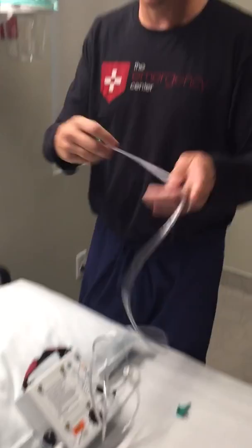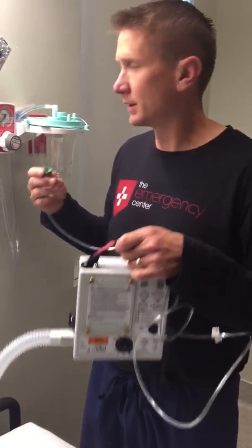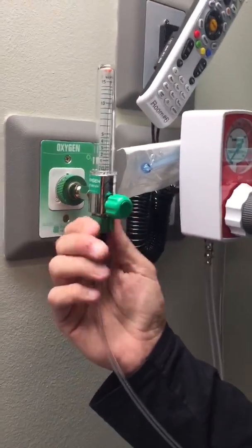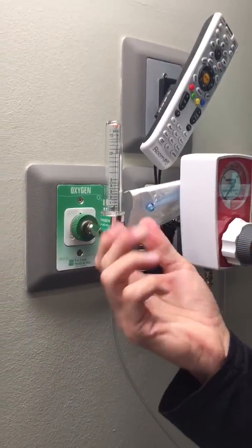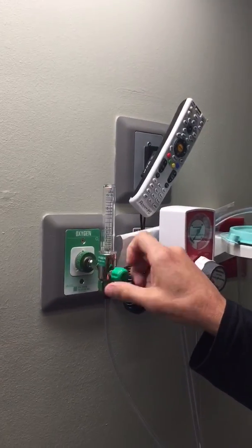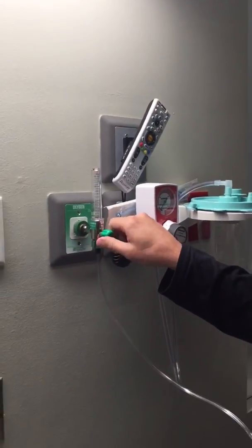The next thing you're going to do is take this connector from the vent and just screw this in down here, and turn the oxygen on all the way so it doesn't open anymore.